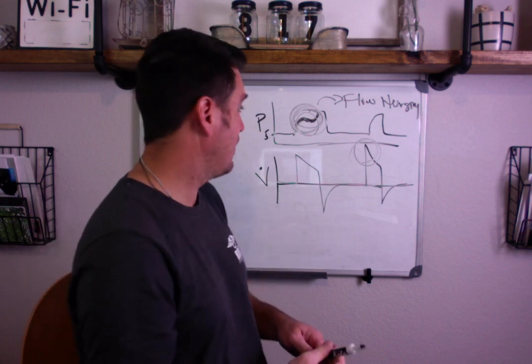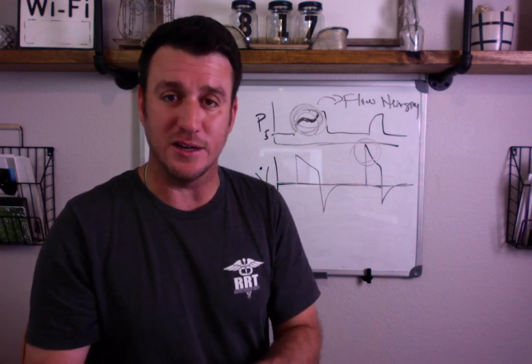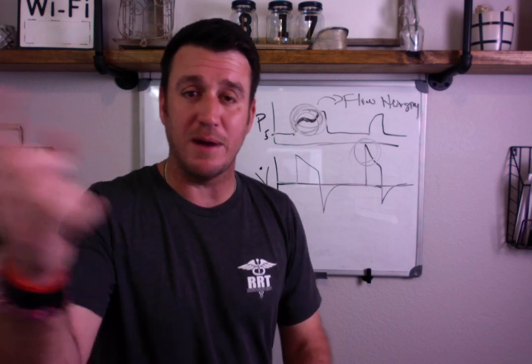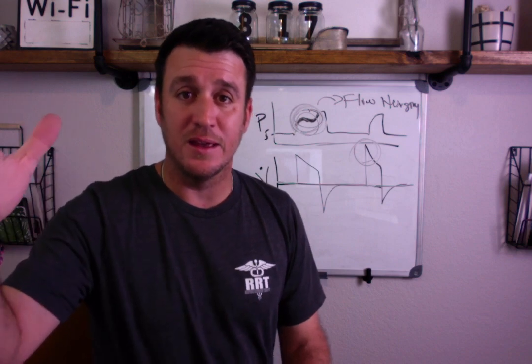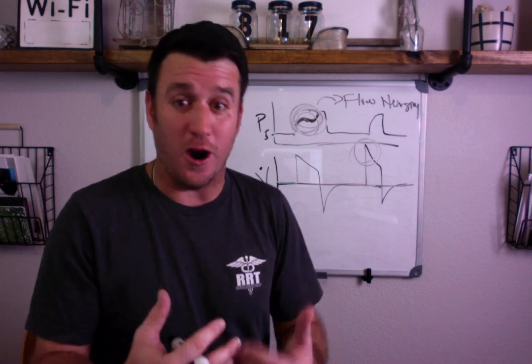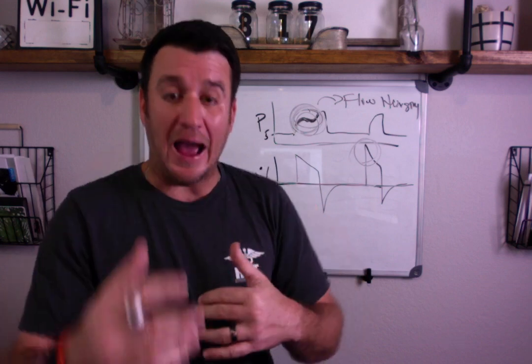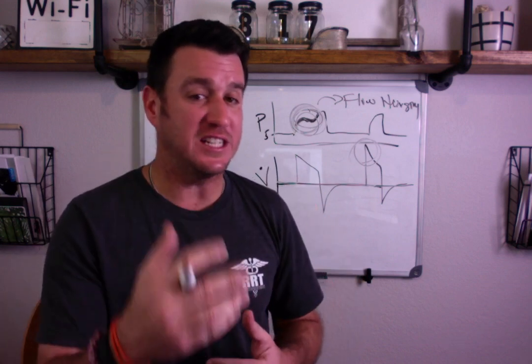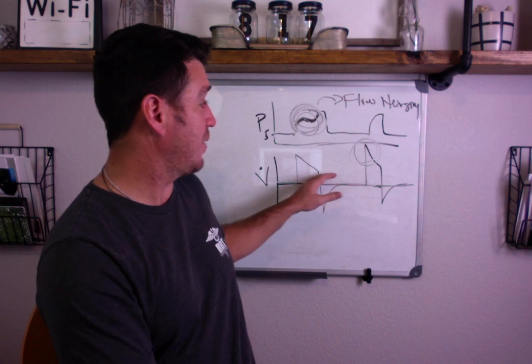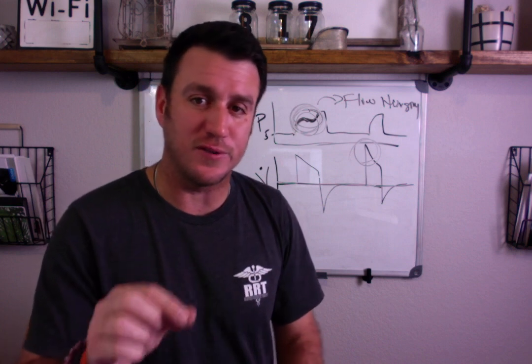Okay? Now, like I said, we got them back down in the 20s, and eventually we were able to turn the flow back down less than 100, and the patient settled down. But when patients get flow hungry, just like you and me, if we go run a mile right now, or 2 miles, or 10 miles, we're going to have to compensate for that. I'm going to be breathing hard. If I run 1 mile right now, I'm going to be breathing very, very hard until the sensation of dyspnea goes away. So as it goes away, that inspiratory flow demand that this patient was requiring up to 140 will decrease, and you can adjust your flow setting.